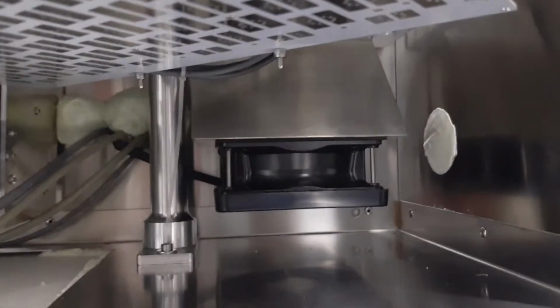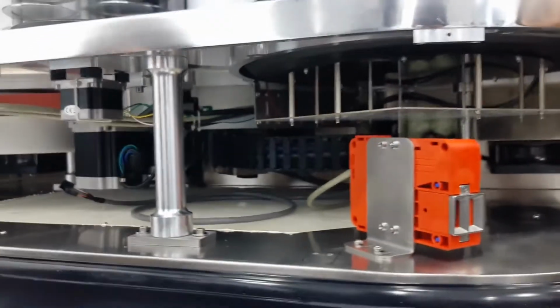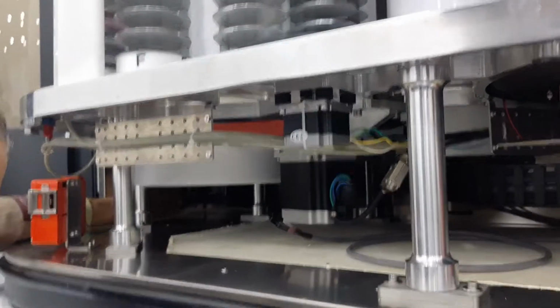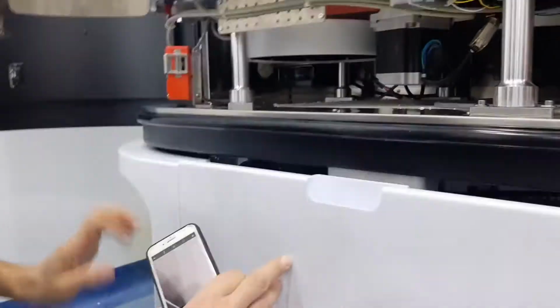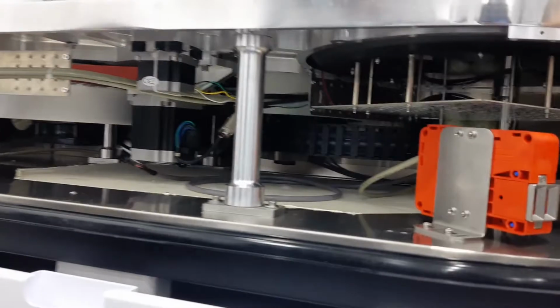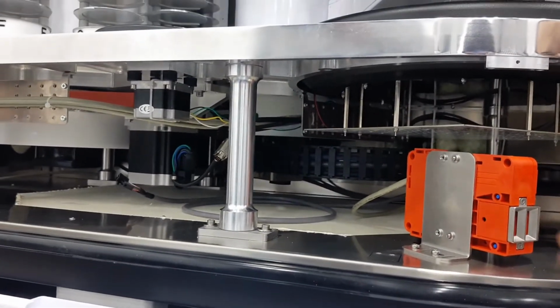Yeah, it's under the fan. The other filter is on the other side. It's the same. It's symmetrical. Yeah, you have one too.